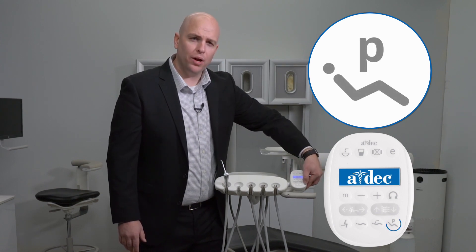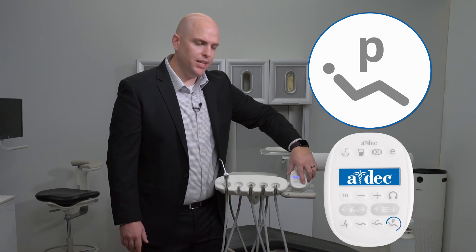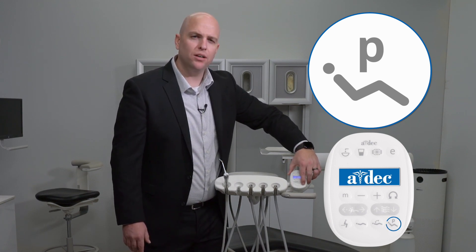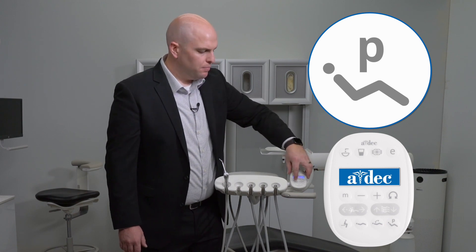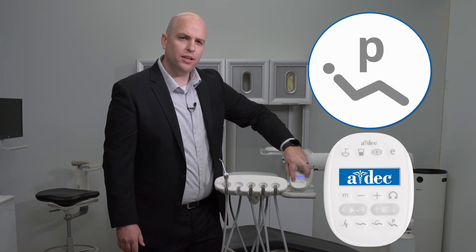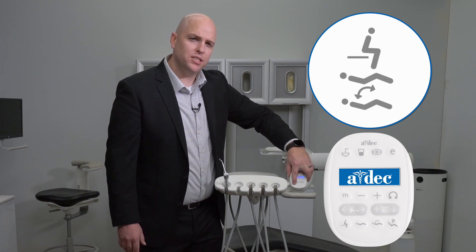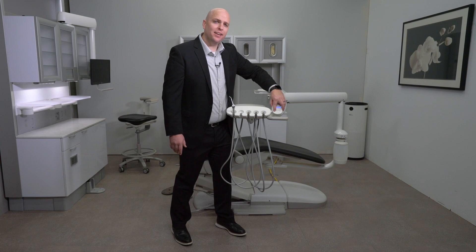On the far right-hand side, you'll see a P — that P is the programming button. To change any of the preset settings, simply press the P and you'll hear one beep. Move the chair to the position that you want, then press the preset that you want it to be remembered as. You'll then hear three beeps to indicate that the settings have been saved.